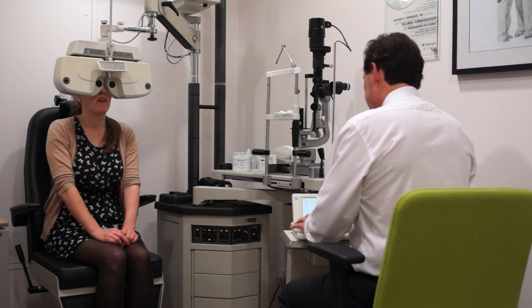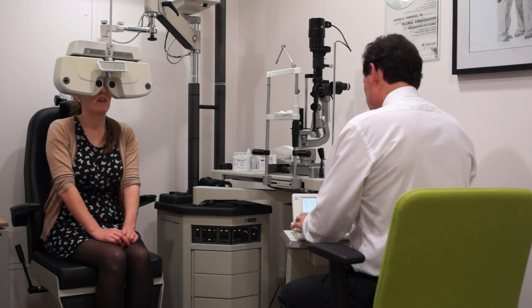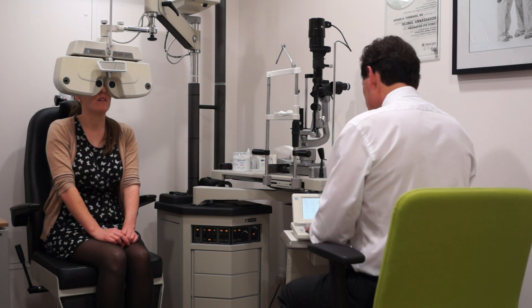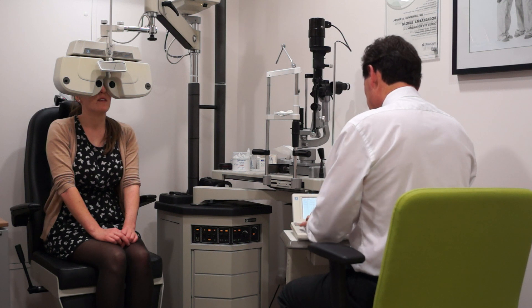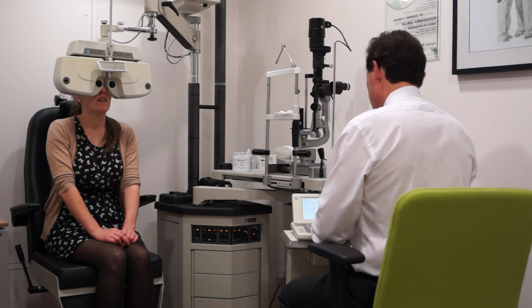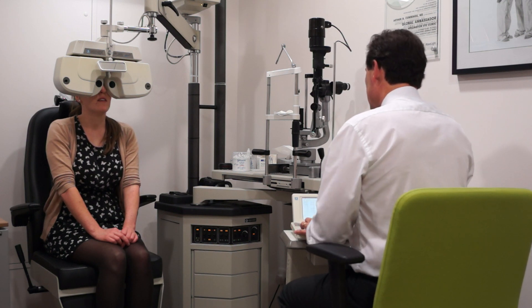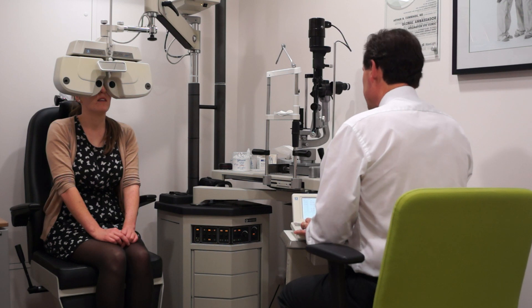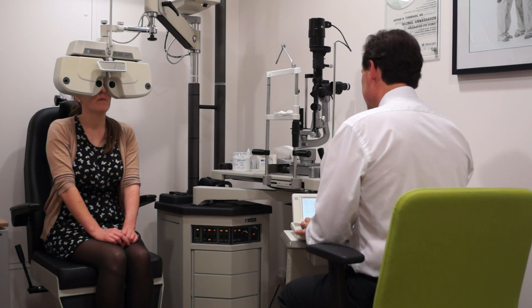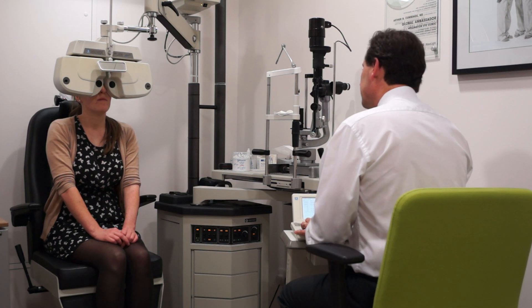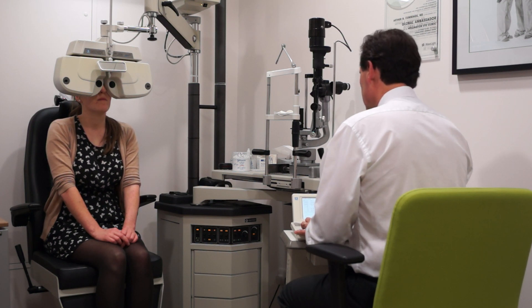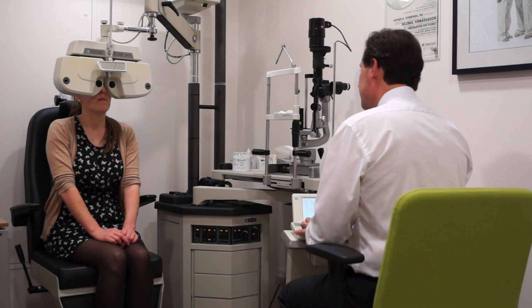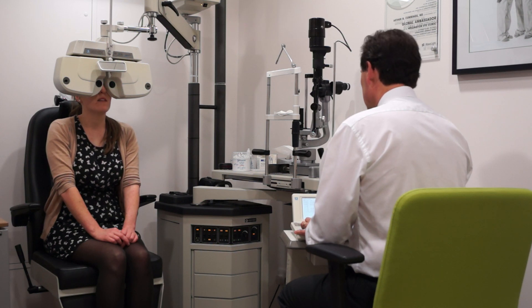Okay. What I'm going to do now is I'm going to see if by doing monovision, we can reduce that. So I'm going to start adding reading vision in front of your left eye. And I want you to tell me at what point you start seeing that 3D isn't so good anymore. Can you still see 3D? Yes. Can you still see 3D? Yes. Can you still? Yes.